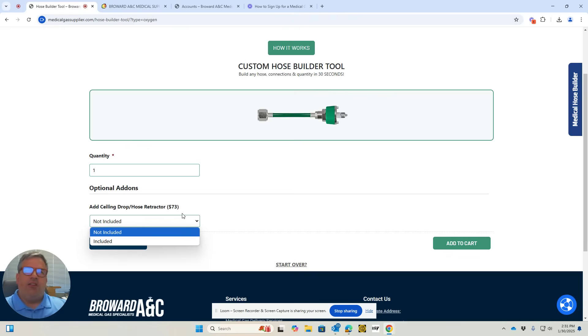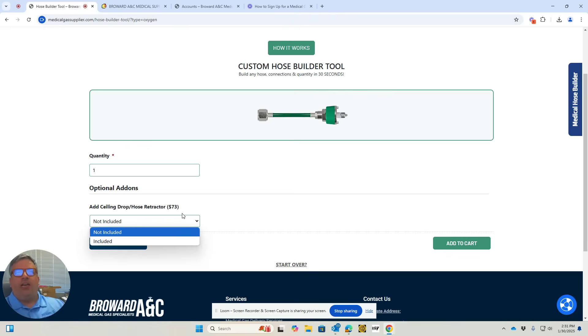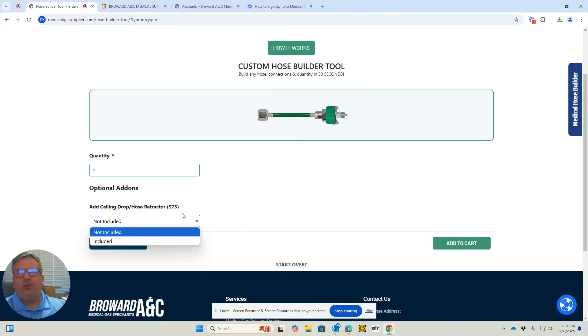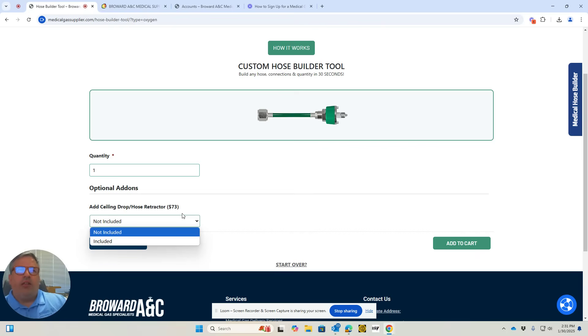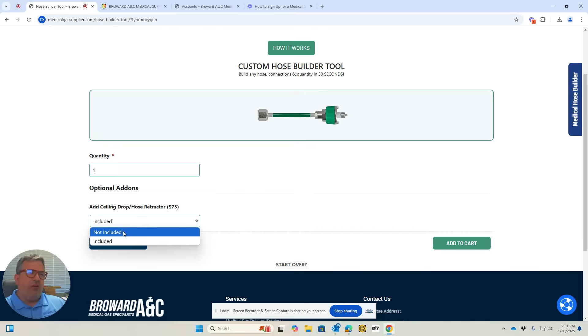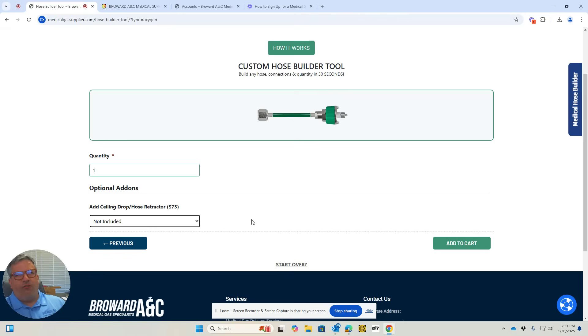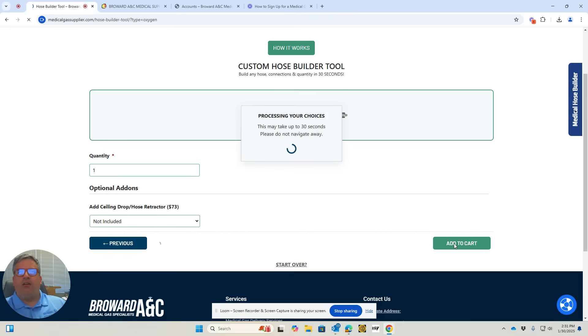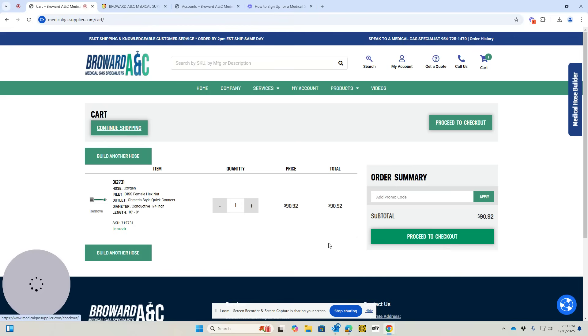It allows you to pull the hose down and connect it. Once it's disconnected, it pulls the hose back up out of the way. You can include that or not—the default is not included. So we'll not include that. I'll hit add to cart, and there you have it.